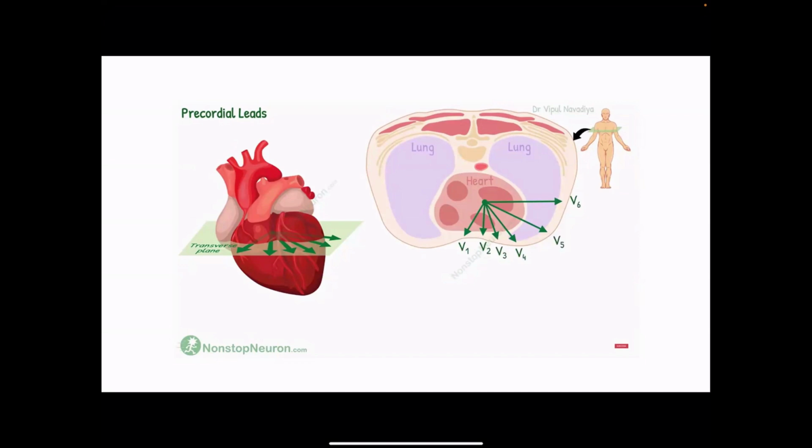It's a piece of paper, it's just up, down, diagonal, okay? These chest leads are really helpful and important because they can read electrical impulses in the transverse point of view. So if we take a cross-section of the chest and we look at it from up, these are the depolarization waves or impulses that these leads can pick up, okay? Or the transverse view in general.